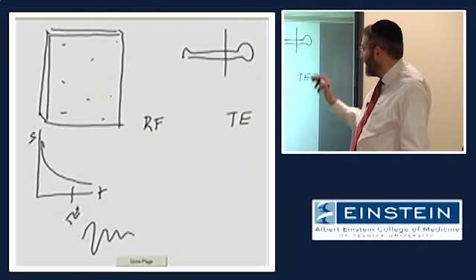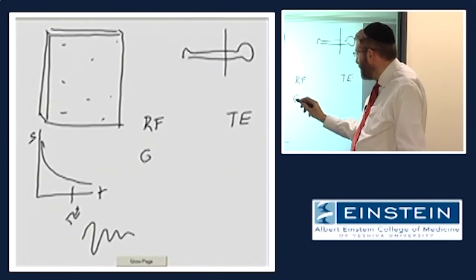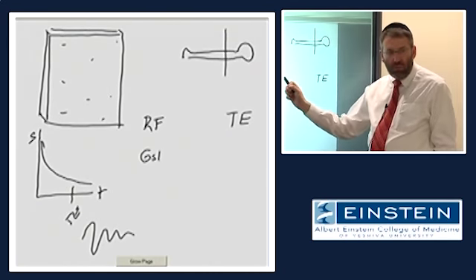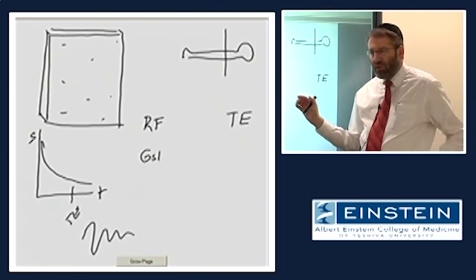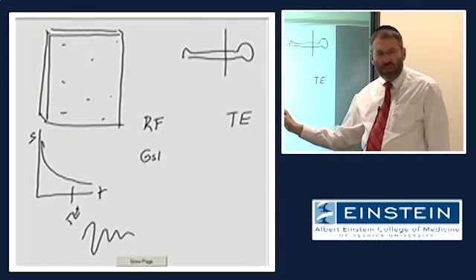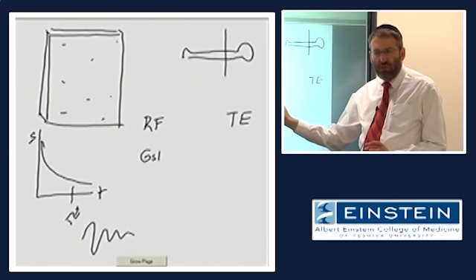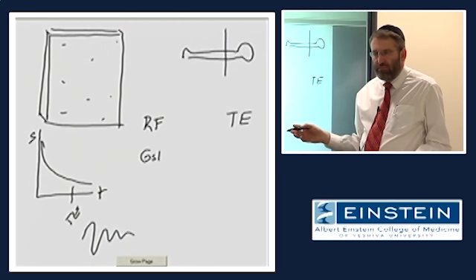In order to select this slice, we have to turn on a gradient magnetic field at the time that we transmit this RF. And if that wasn't clear, this is an essential point. Slice selection only works if the gradient magnetic field you're going to use to select your slice is on while you transmit the RF. Otherwise, it has no effect.